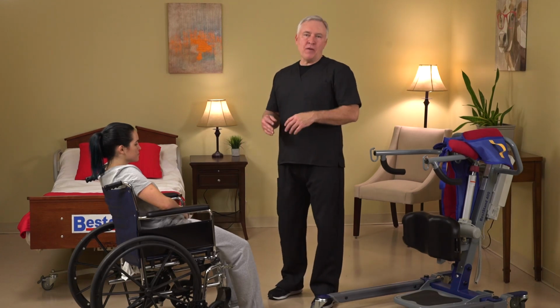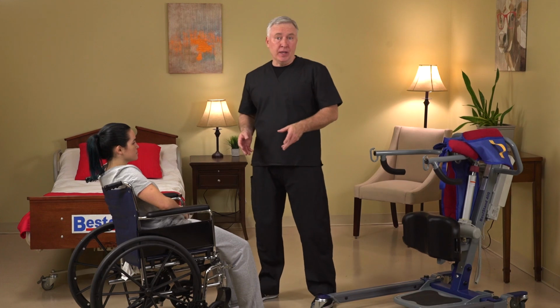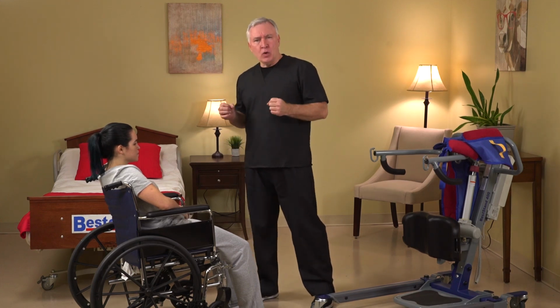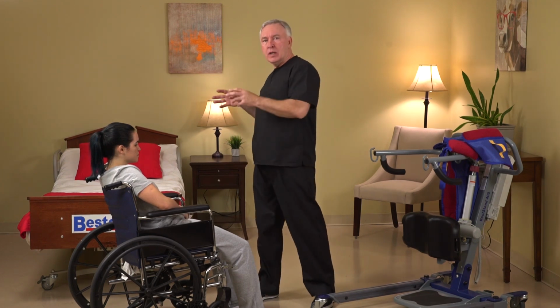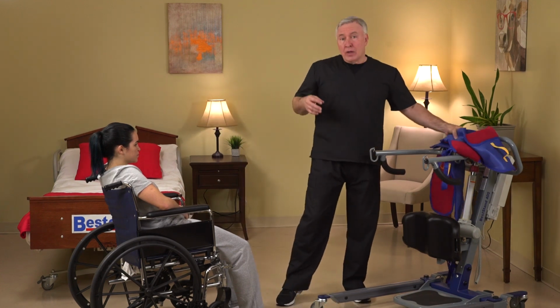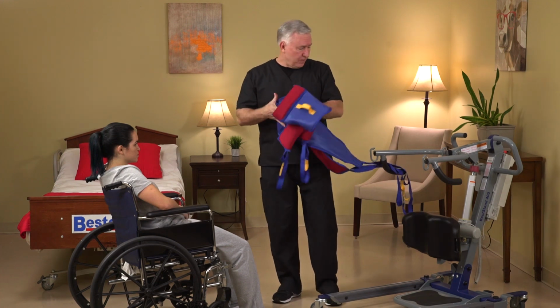Okay folks, now it's time for me to show you how to use the BestStand with the Sani sling to transfer a patient who doesn't bear enough weight to stand up in a normal standing position with the sit-to-stand sling. So we're going to transfer that type of patient from the wheelchair to the bed. We get a lot of questions about the Sani sling and the need to support patients who can't hold themselves up into a natural standing position.